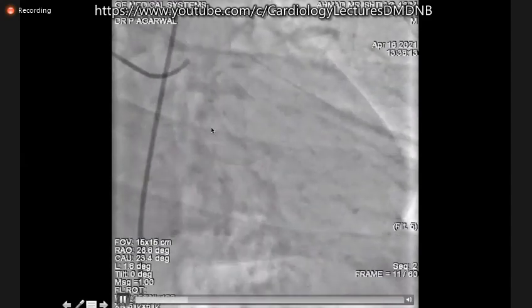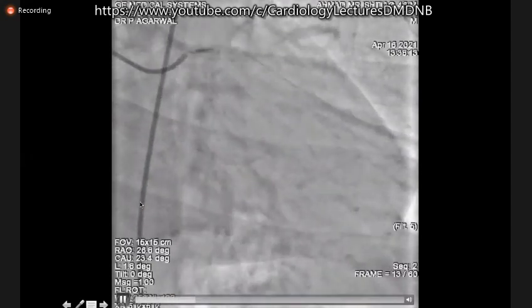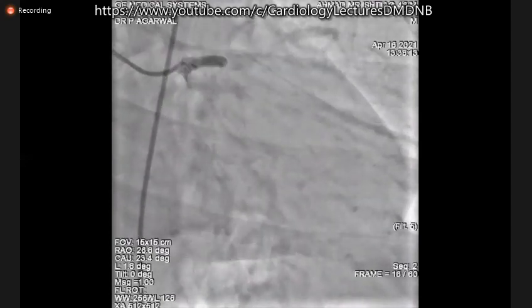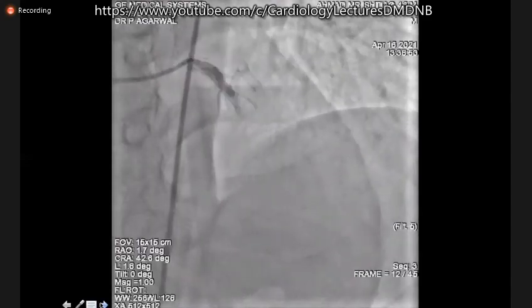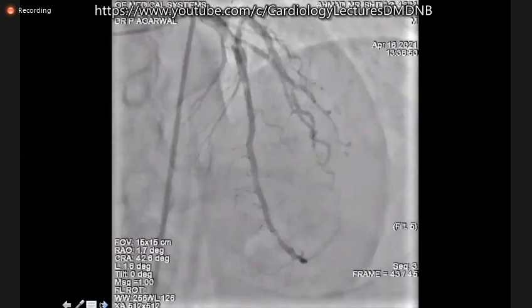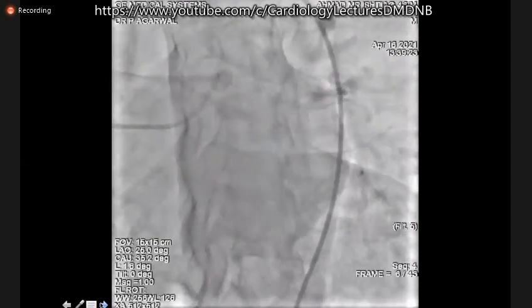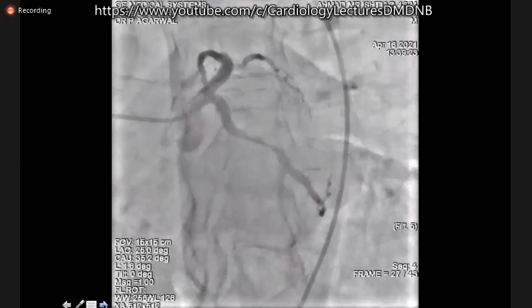And this is a new lesion which has come up in the circumflex. By the looks of it, he's a diabetic, young patient. These lesions are all very fibrotic. They do not give way easily. Let us see the next shot. LAD is doing fine. Now see the circumflex. It looks easy, like you just go with the balloon and do that. No, these lesions are very hard.